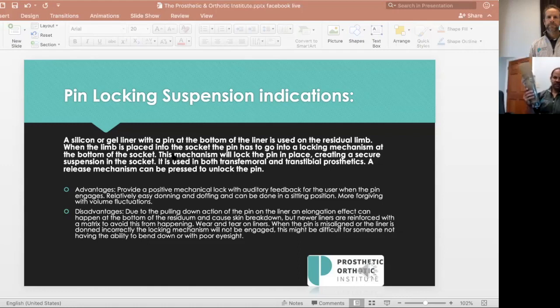So all of those aspects of anatomy are key for patients to understand. In fitting this prosthesis and fitting a patient with a patella tendon bearing suction elevated vacuum, it is important that the patient understand their anatomy and understand that they are not going to be a consistent fit every day of a 2-ply or a 3-ply or a 5-ply, especially initially after the amputation. And it is crucial that we educate patients on that.